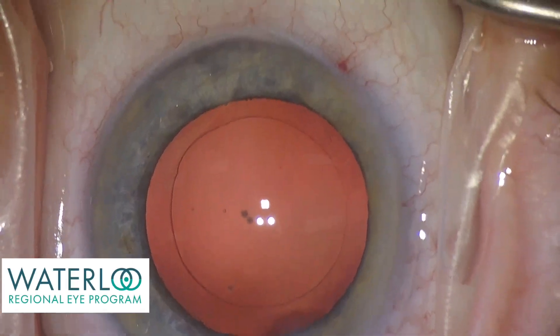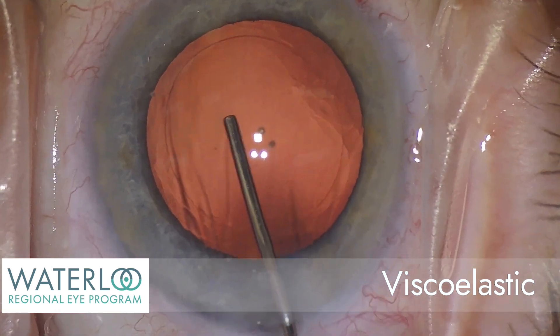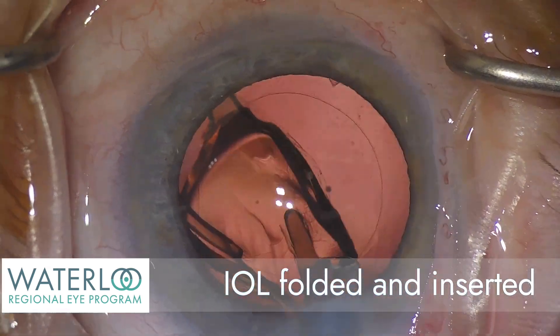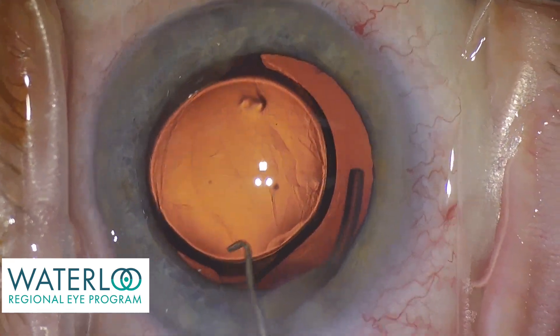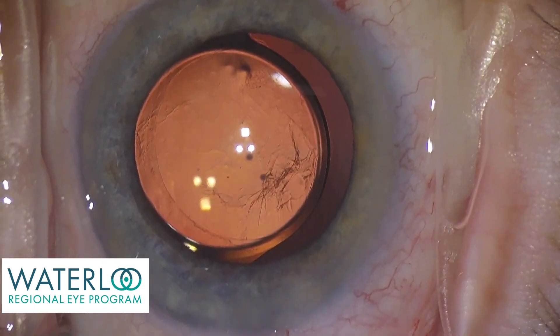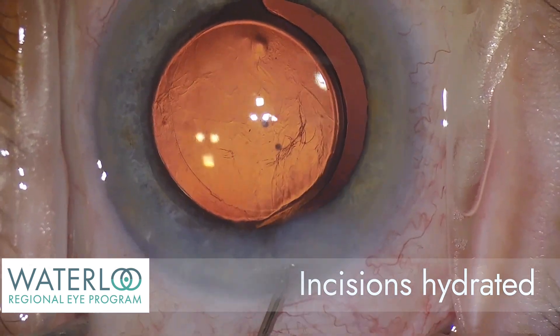The capsule is filled with viscoelastic, a gel-like material that maintains the eye pressure, and a one-piece artificial IOL implant is folded and inserted into the eye through the small 2.2 mm incision. The implant unfolds and opens inside the capsule, the natural support system of the eye that will keep the implant centered in place.